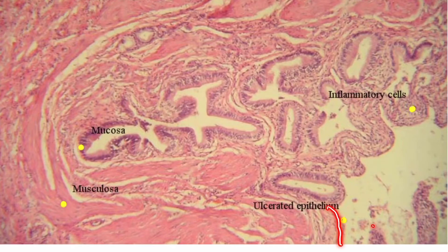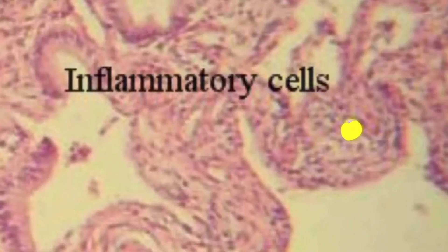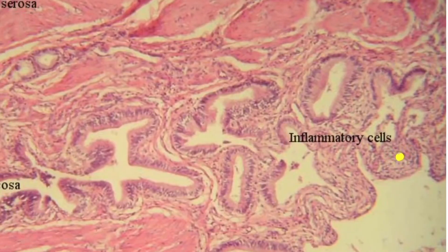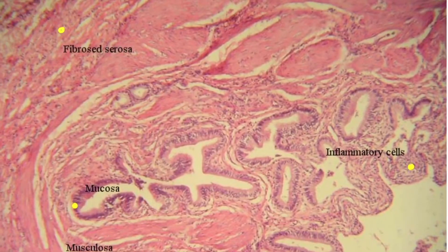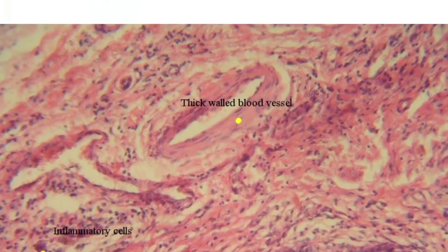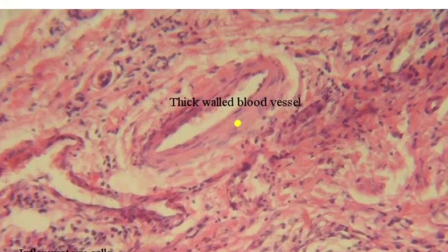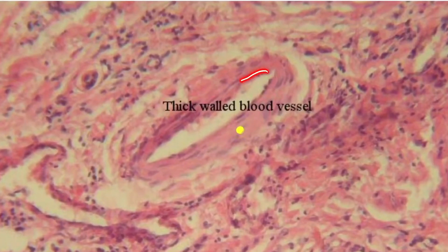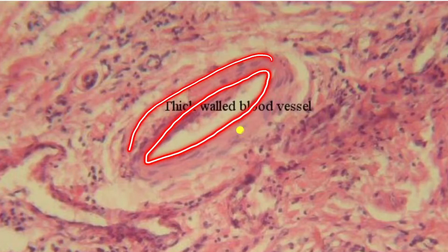Here you can see this is the ulcerated epithelium — the formation of the ulcer in the epithelium. Next, you can see those are the inflammatory cells. Here also you can see the thick-walled blood vessel — this is the inner wall and this is the outer wall of the blood vessel.